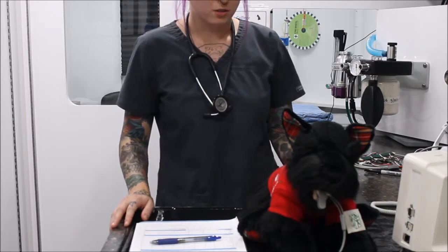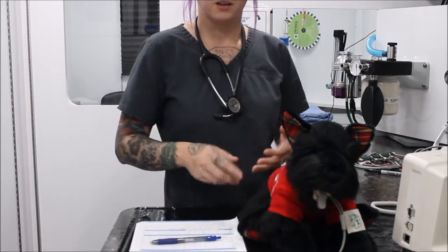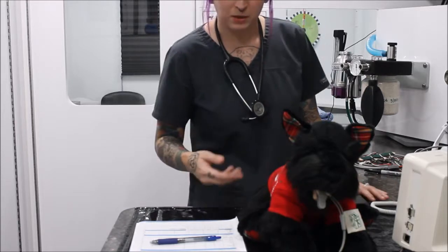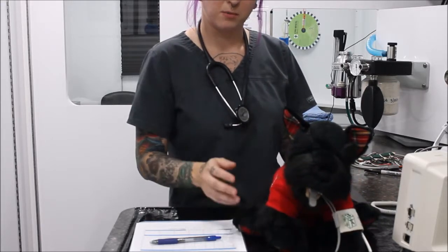Along with monitoring our patient's physiological status under anesthesia, we also need to monitor their surgical plane and surgical stage of anesthesia. There are some different ways you can do that. Along with measuring the physiological status, determining respiratory rate and heart rate, those things can also tell you what surgical plane and stage your patient is in, but there are some reflexes that we can check as well, just to make sure that our patient is going under anesthesia and they're at a nice depth or stage.